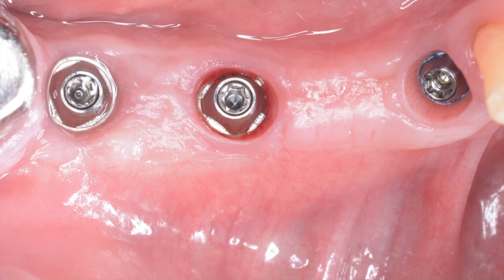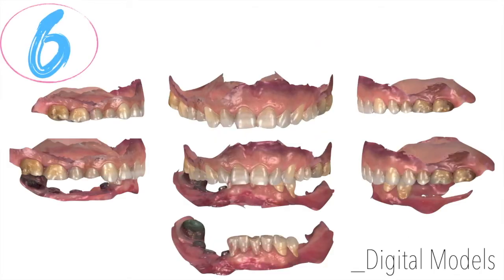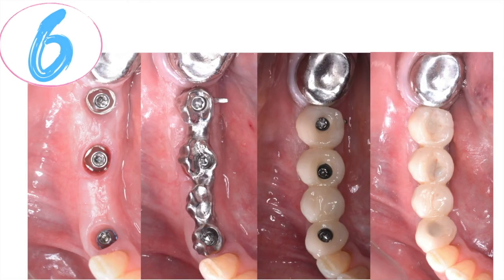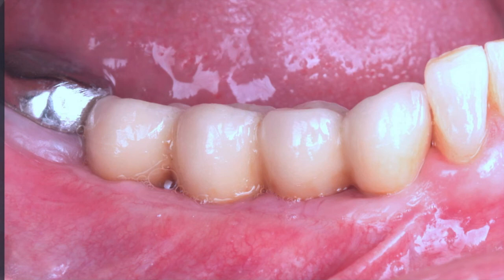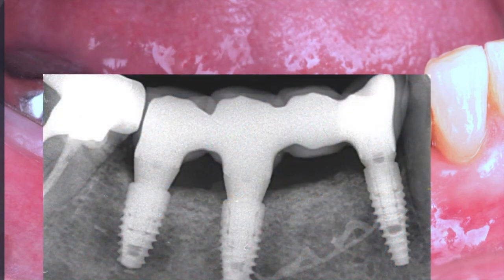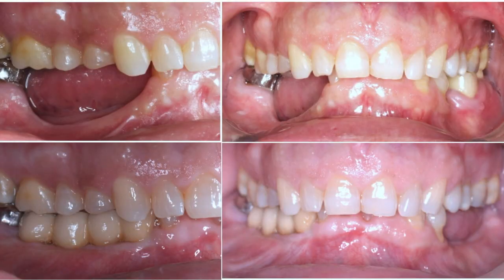After waiting two to three months for keratinized tissue integration, we begin the digital prosthetic phase. Digital impressions are taken to produce digital models for ceramometal crowns over multi-unit abutments. The final crowns show perfect adaptation in the patient's mouth, with stable peri-implant marginal bone and a stable regenerated area. A comparison between the starting point and the final metal-ceramic prosthesis demonstrates the excellent outcome.